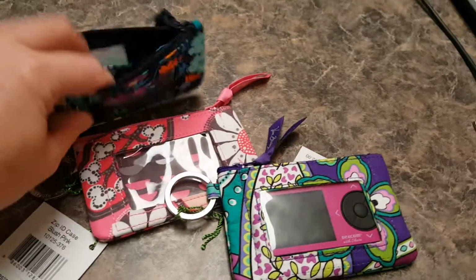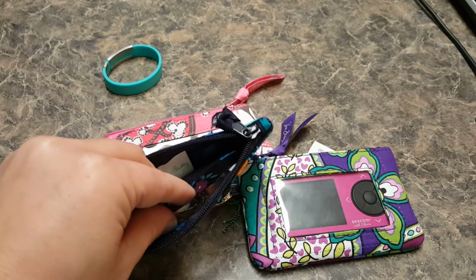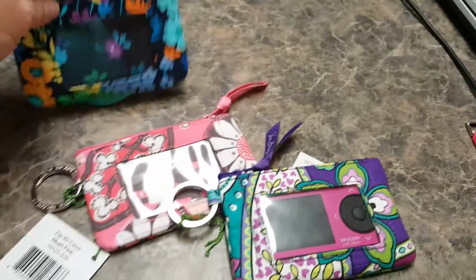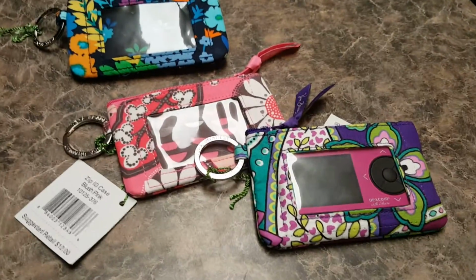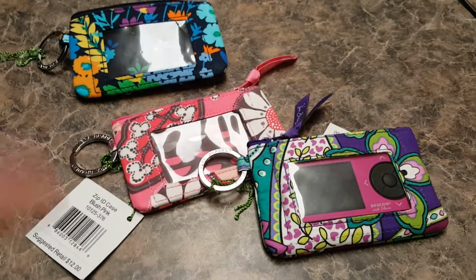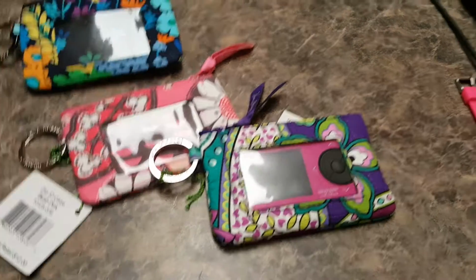So a lot of people will take this little part that holds it in, turn it inside out, and just cut that flap out. I like the flap and I wanted to keep it. So I decided, instead of cutting that flap out, to take the seam out that holds the flap against the front. So we have done this for a while now.